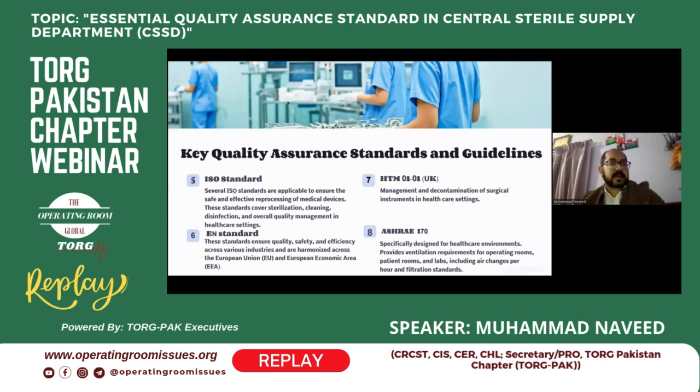So the fifth one is the ISO standard. Several ISO standards are applicable to ensure the safe and effective reprocessing of medical devices. These standards cover sterilization, cleaning, disinfection, and overall quality management in the healthcare setting. So in the coming presentation, we will discuss the ISO standard and EN standard briefly.